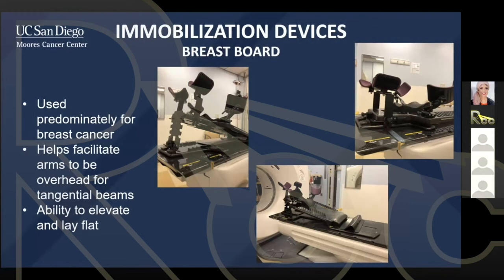I think one of the reasons it's flat for 3-field patients is so that the machine is more en face, so there's not as much of an angle when you're treating the patient's supraclav. Also beam divergence: if the patient is lying flat, they're a little bit further from the machine and you can get more radiation beams to the patient.